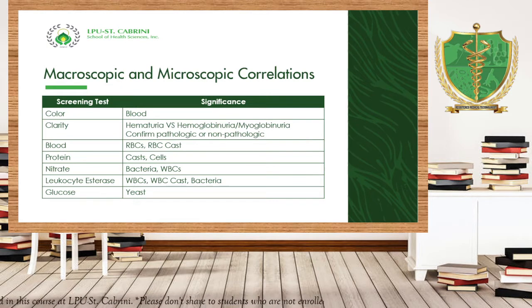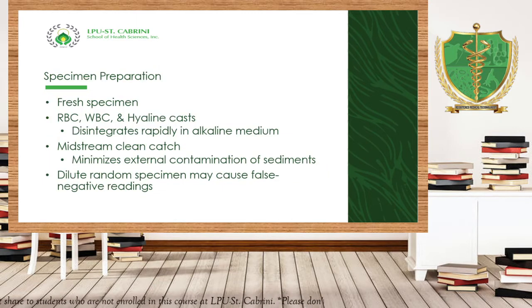Okay, so those are the things that we have to remember in correlating the results of our microscopic examination as well as the macroscopic examination of the urine. Okay, now how are we going to prepare the specimen? Definitely, it is recommended that we should have a fresh specimen. Although, according to Strasinger, up to 2 hours, pwede pang gamitin ang ating mga urine sample.